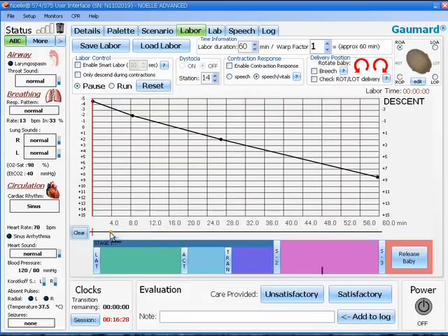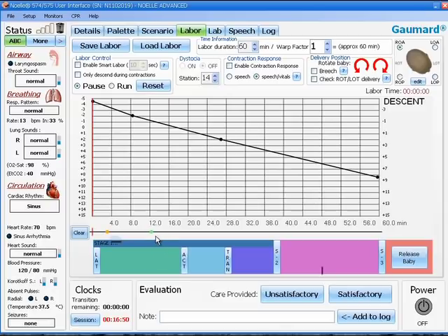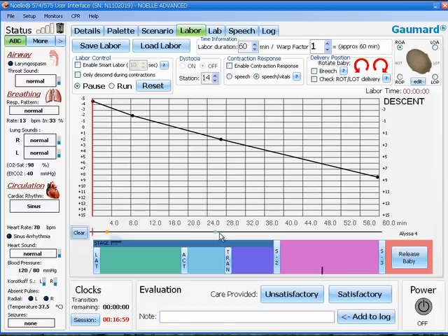Once you have added the palette to the line, you will notice a point on that line. It will be green, yellow, pink or blue, or if it is a speech item, it will be orange. The pink, green and yellow icons designate whether the palette is considered to be a healthy, critical or care required item. If you left click on the palette, you can slide it left and right along the line. You can add up to 18 points along this line.